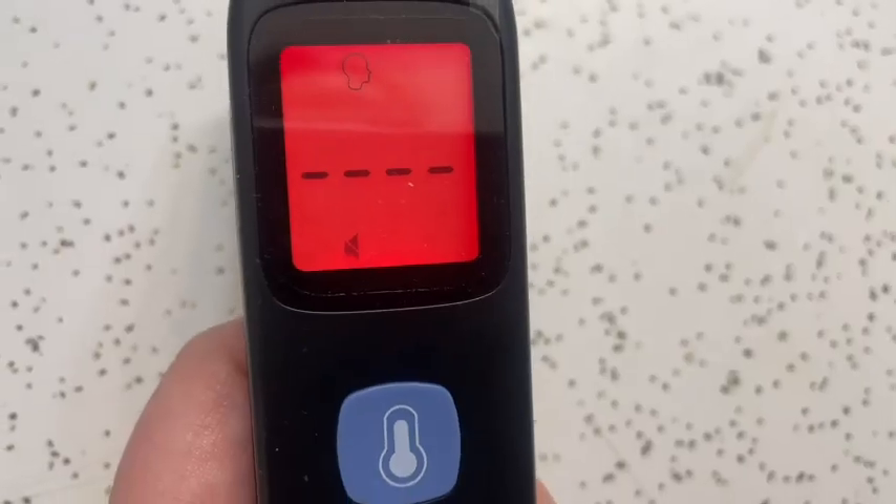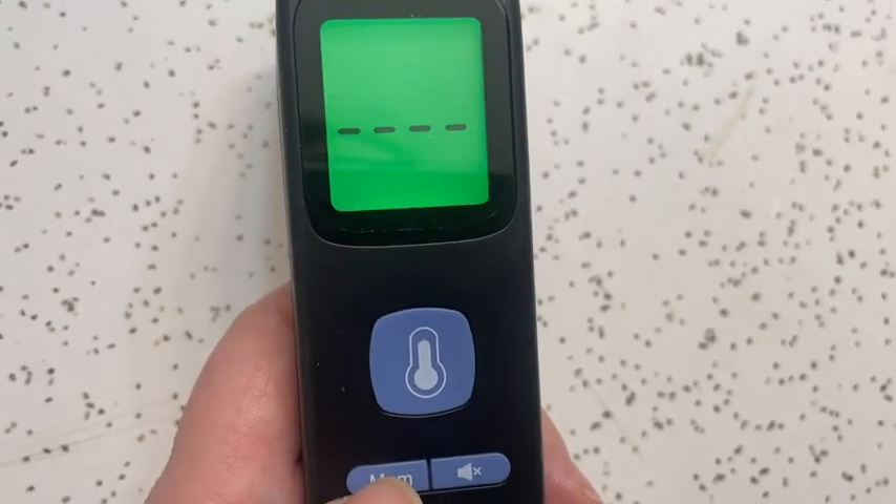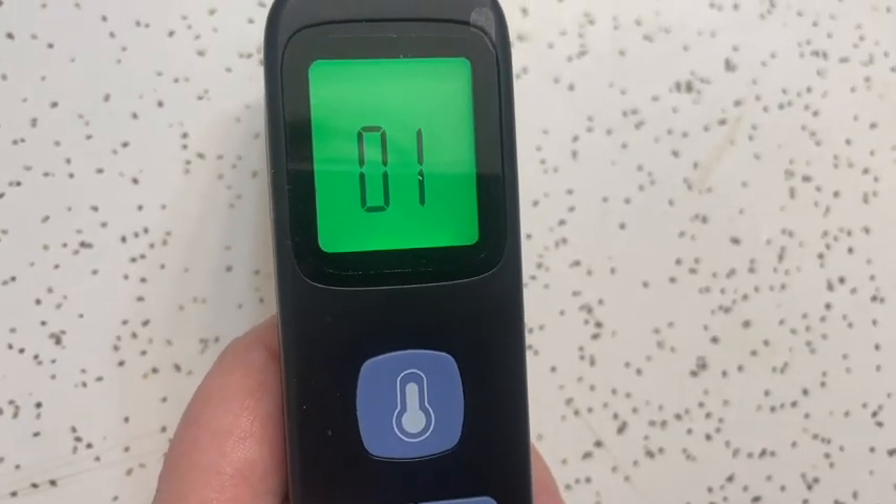If I had a fever, it would turn different colors. Orange means 'watch your body, listen to your body,' and red means you have a fever and should probably take some medicine. I definitely recommend this — it's a great pick. It also has a memory feature, which is cool. So try it out — that's my point of view.